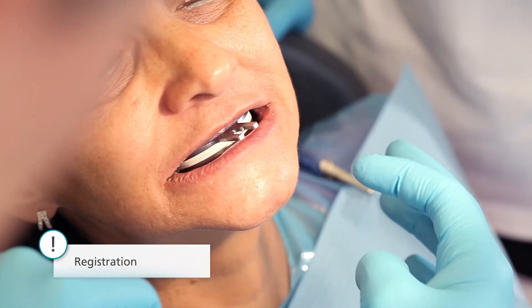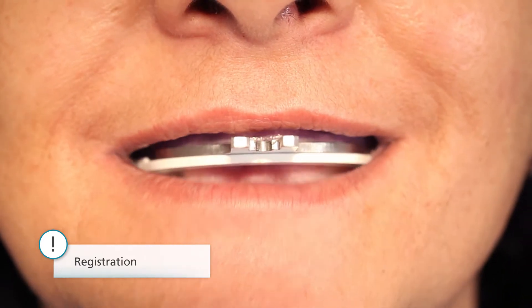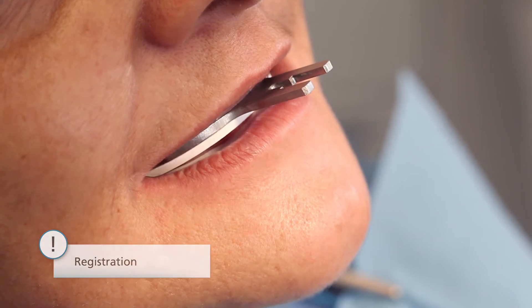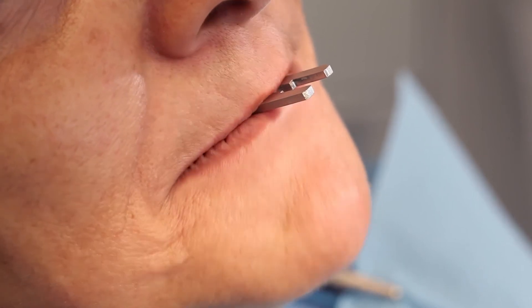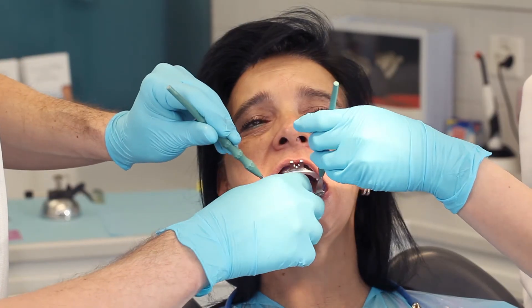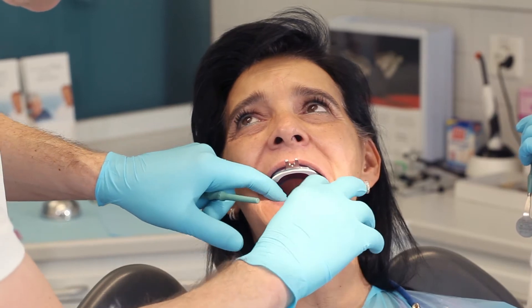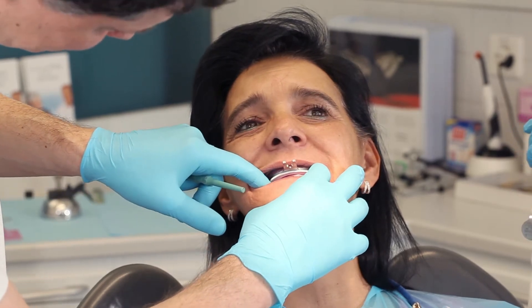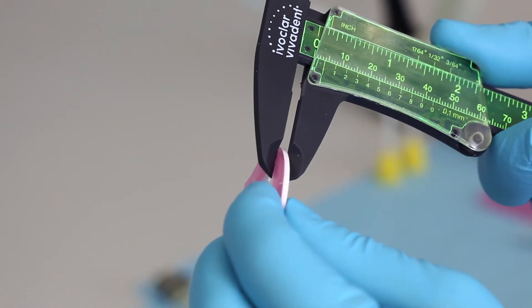By testing the patient's speech, check the vertical dimension and then make any necessary adjustments. Ask the patient to say words such as '66' or 'Mississippi,' or have them count from 60 to 70. If the vertical dimension is too high, the bite rims will touch each other when the patient speaks — in this case, remove one of the rims and test the situation again. If the vertical dimension is too low, you can increase it in millimetres with a wax plate.